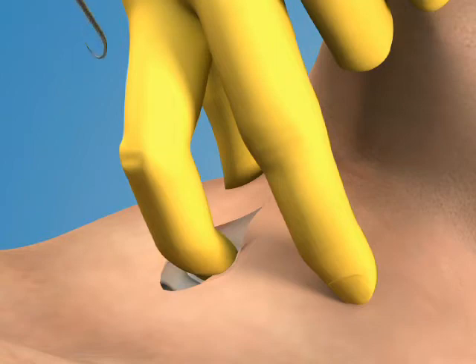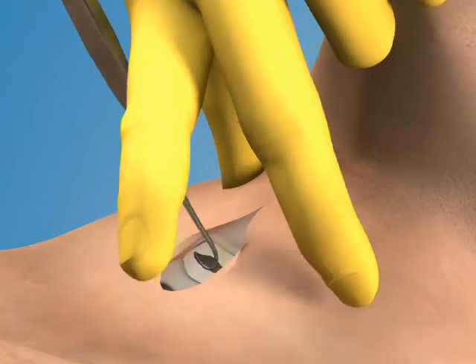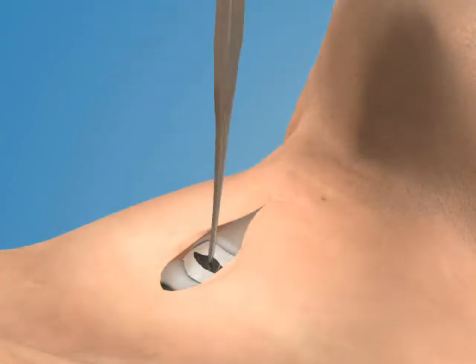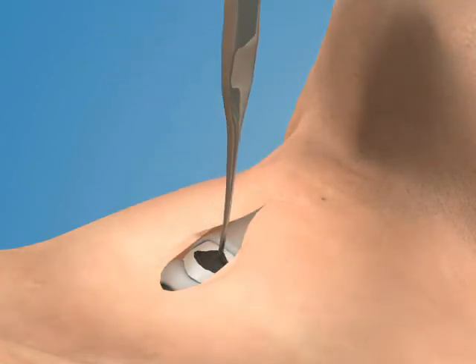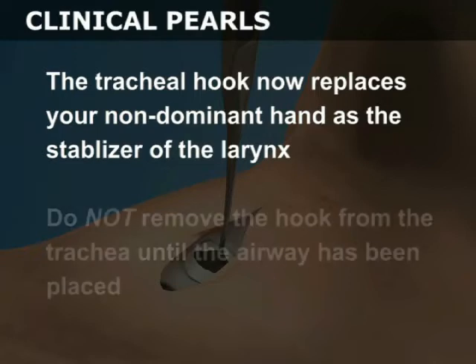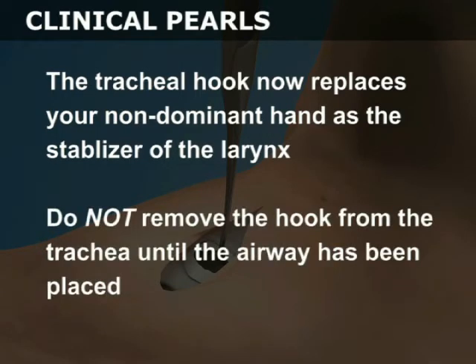Next, place the tracheal hook into the opening in the membrane. Rotate the hook cephalad and pull it gently toward the ceiling to snare the inferior aspect of the thyroid cartilage. The tracheal hook now replaces your non-dominant hand as the stabilizer of the larynx. Do not remove the hook from the trachea until the airway has been placed.